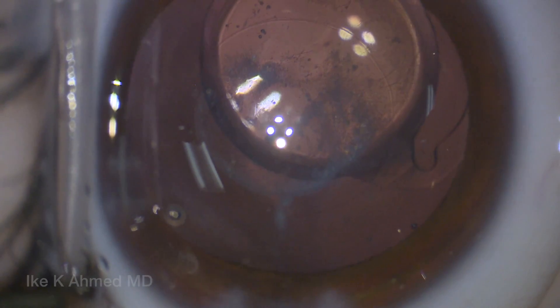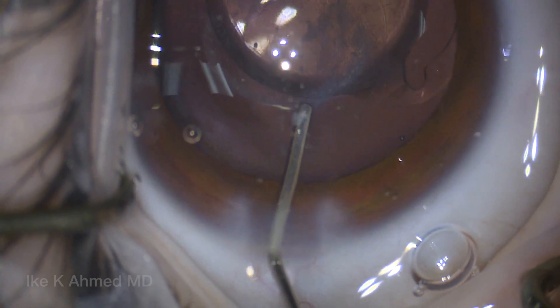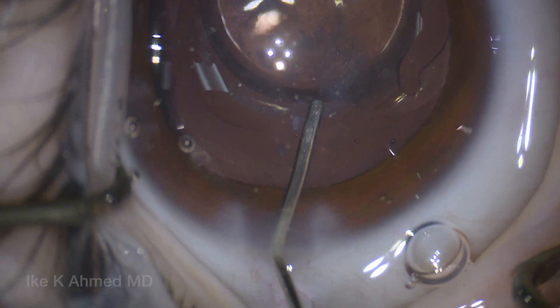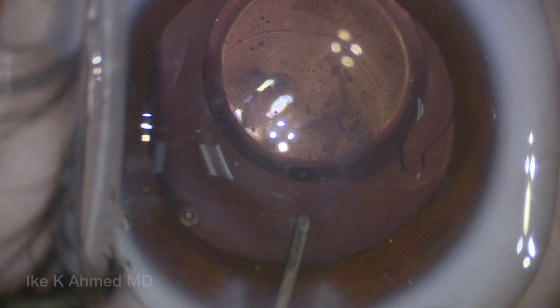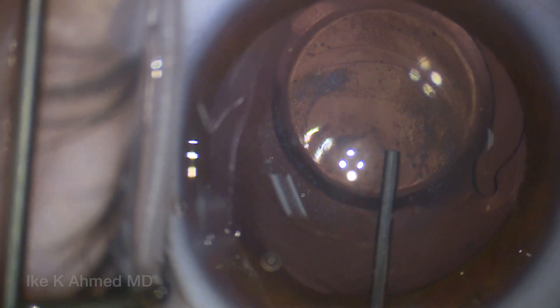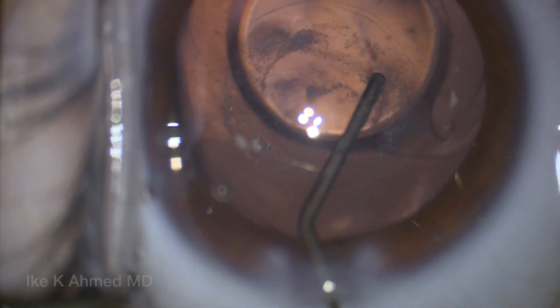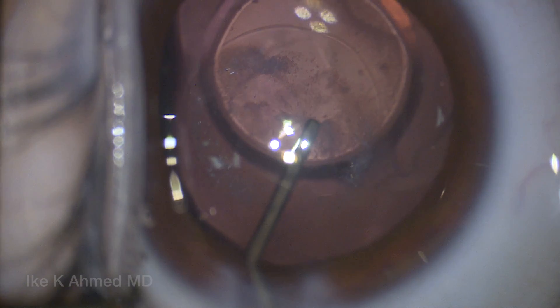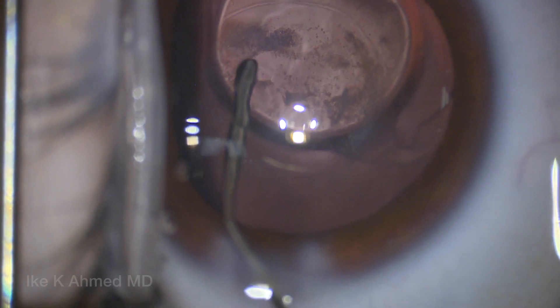You can see we removed some of that lens and capsule opacity, but there are still these little dots and opacities present on the anterior hyaloid. You can see we're vacuuming with a BSS cannula, trying to clear that visual axis as much as possible. We had a decision to make: do we go with vitrectomy and try to remove that anterior hyaloid face, thereby removing the opacities, or try to vacuum enough to give our patient adequate visual recovery? There are advantages in not having to do vitrectomy here.